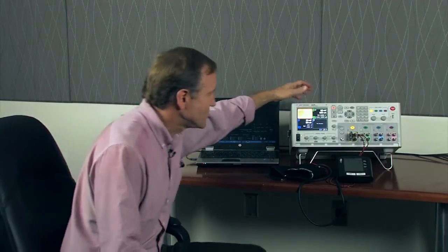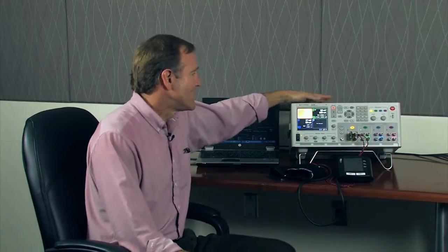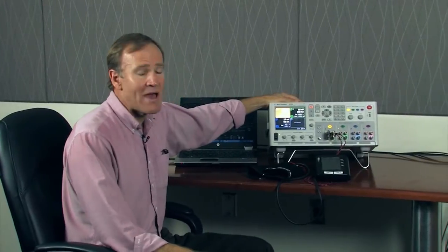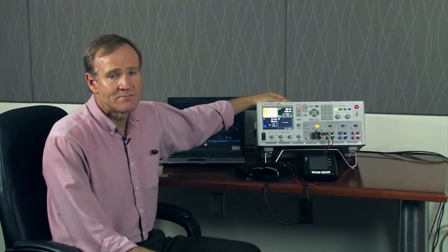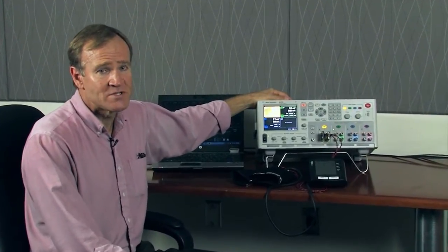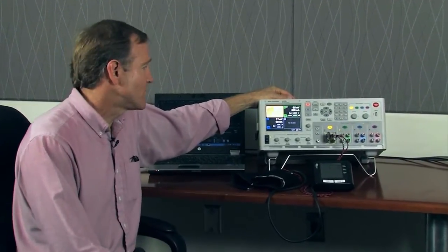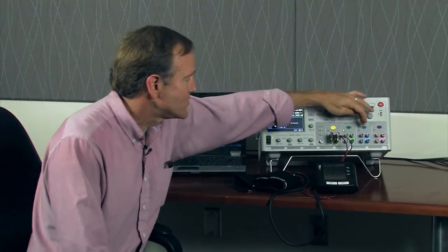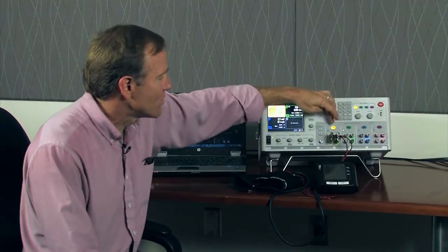So let me show you the solution that we have. This is a DC power analyzer. It's a general purpose R&D tool for an R&D bench. It has four modular supplies.